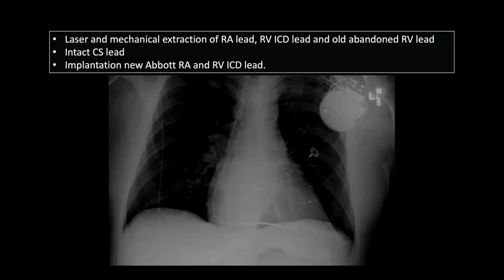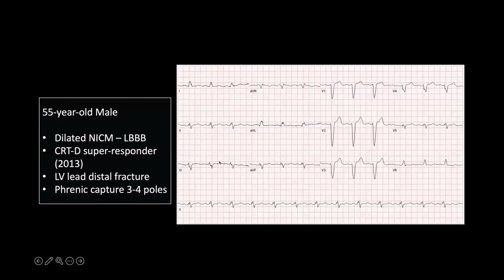So very happy with the outcome. The CS lead, amazingly, remained intact. So we reimplanted the RV ICD lead and a new right atrial lead, and the patient had a great outcome.